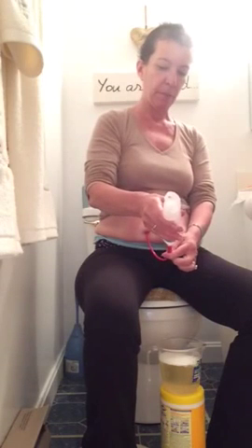Sometimes I see if it'll come out. Nope. And you just drain that out. This helps with keeping the mucus not so thick and viscous. The flush may or may not all come out. That's okay. It's saline provided. You can get it at any medical supply store. It's also provided by your medical provider when you get home from surgery, and they send it to you, depending on what your insurance is.